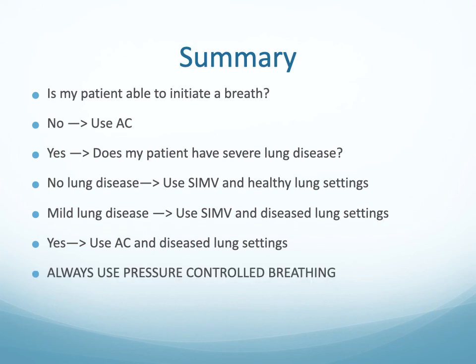Always use pressure controlled breathing, so make sure your breaths are pressure controlled, not volume controlled, because that will allow for less lung injury. And use your CPAP for weaning off the machine.